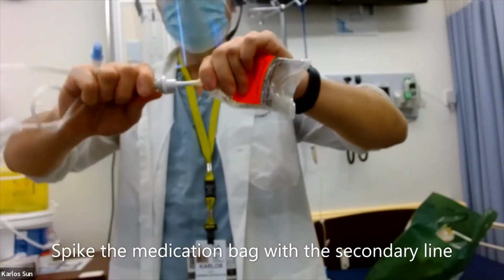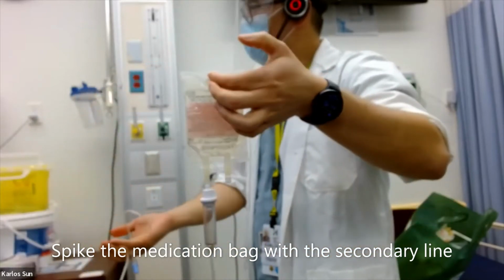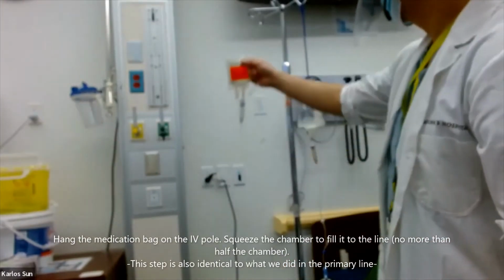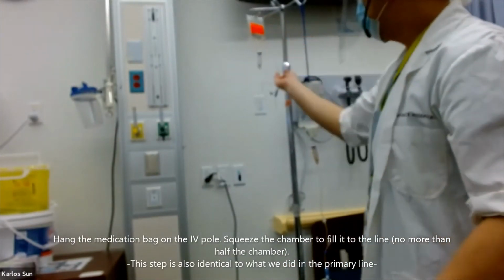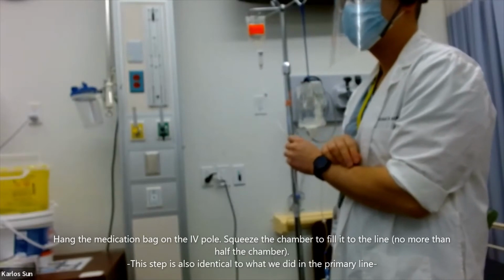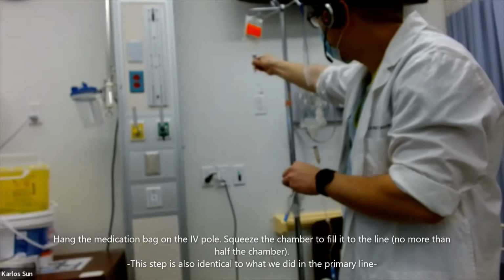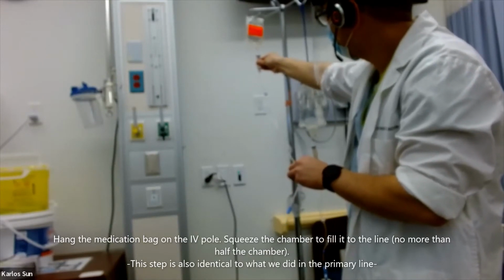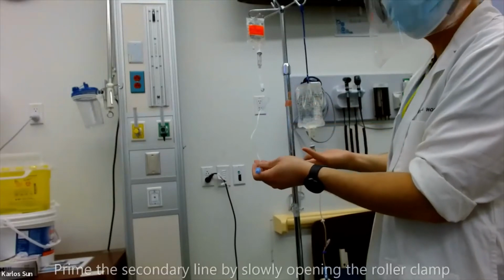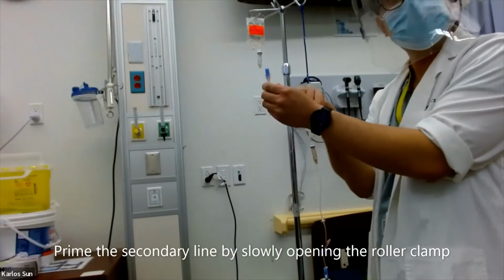Spike the medication bag with the secondary line. Hang the medication bag on the IV pole. Squeeze the chamber to fill it to the line, but no more than half the chamber. Prime the secondary line by slowly opening the roller clamp.